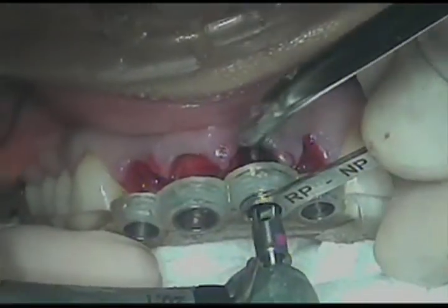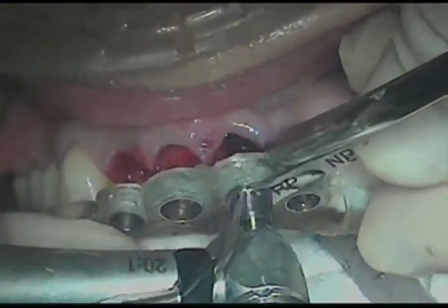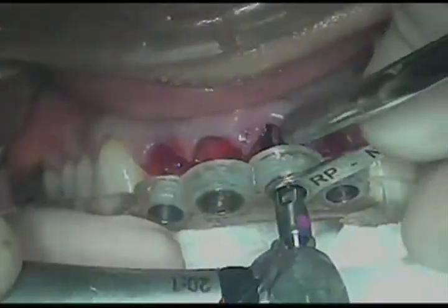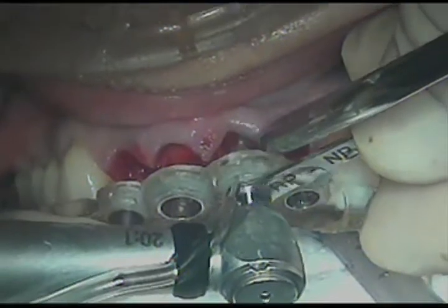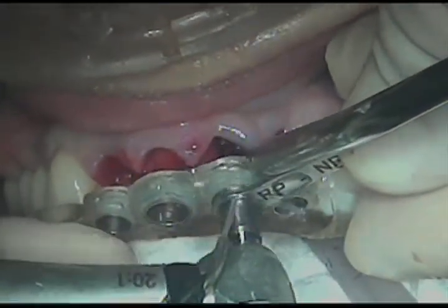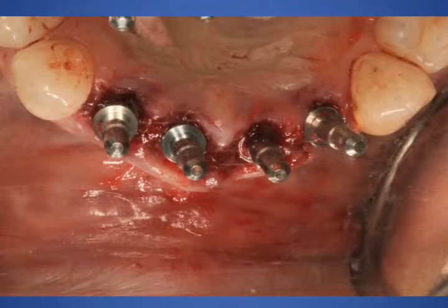This video illustrates we're using a key for the 4.3 millimeter central incisors. This key is 3.5 millimeters in diameter. So we use the 3.5 millimeter drill to drill to proper depth, again 13 millimeters. Here we're using paralleling pins, again, just to take a look and make sure that we're in the correct position, that we feel comfortable with everything we're doing at this time.